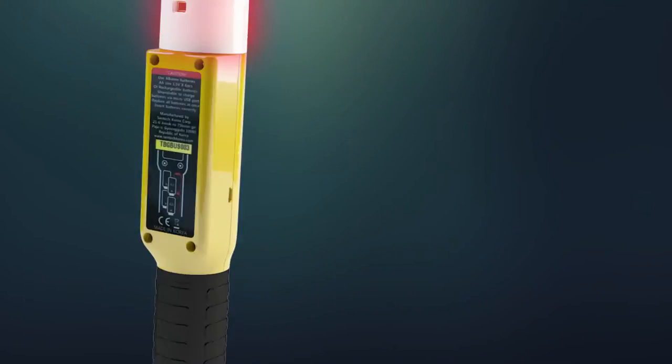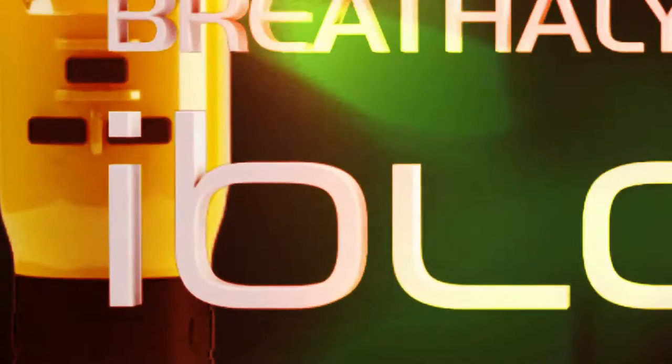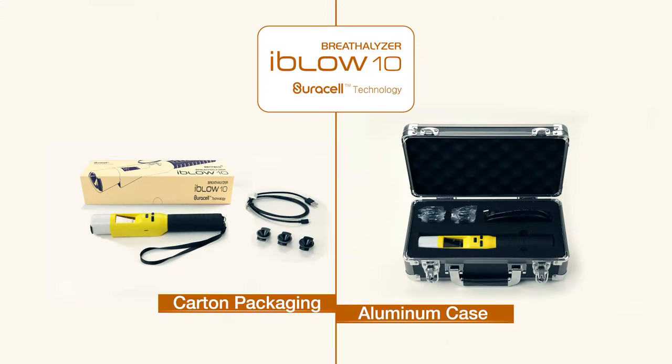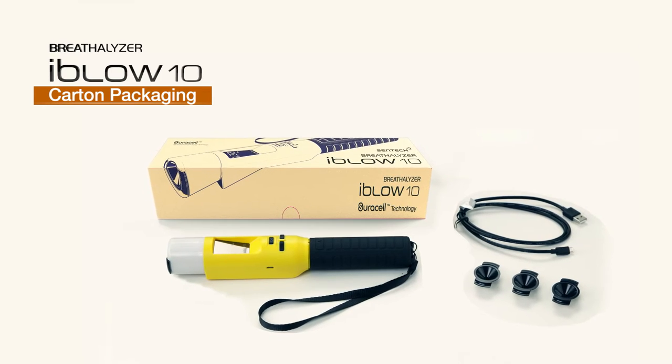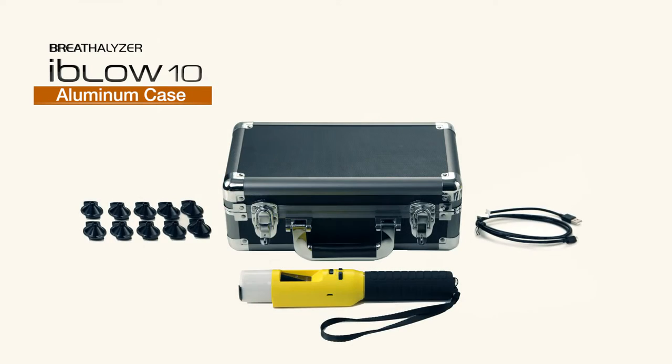iBlow 10 is made with the know-how and technology of Sentech, the world's best maker of breathalyzers. iBlow 10 comes in two packages: the basic package, which comes in a carton packaging, or the advanced packaging, which comes in an aluminum case.